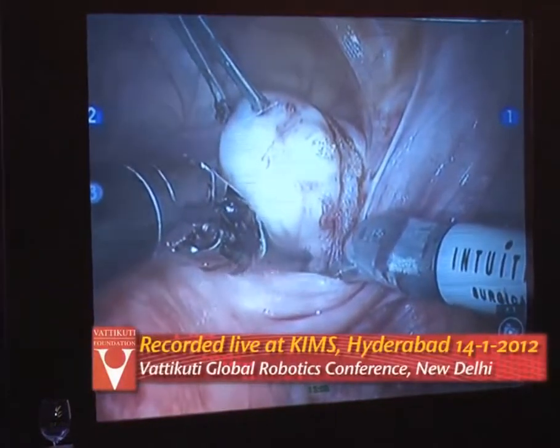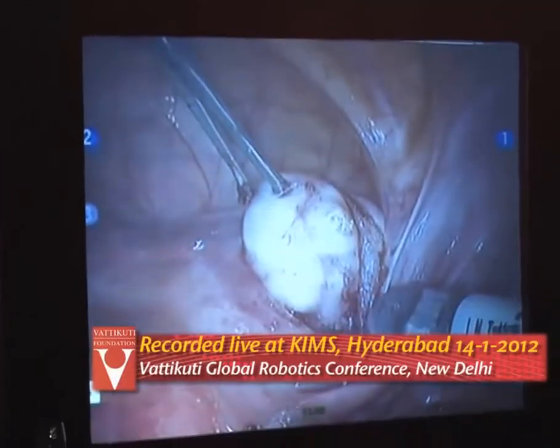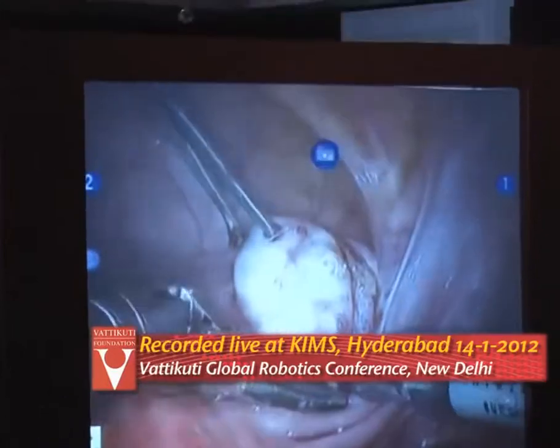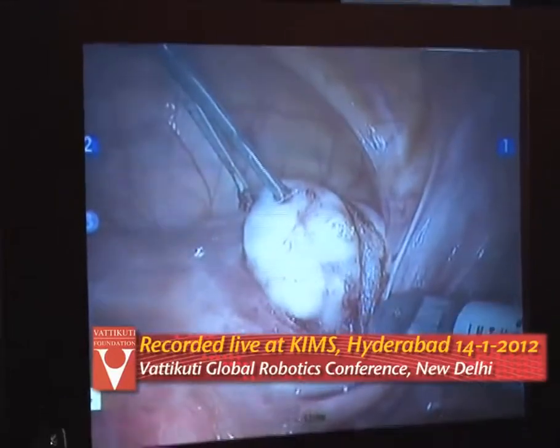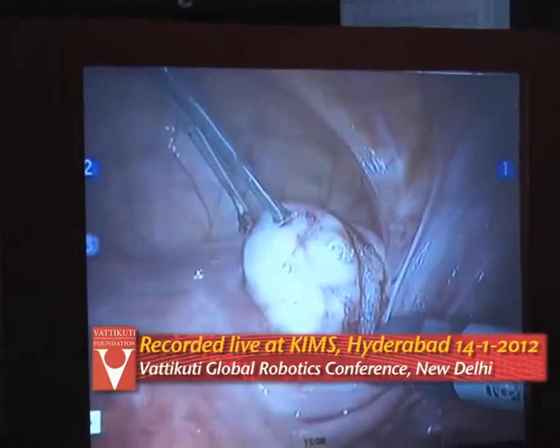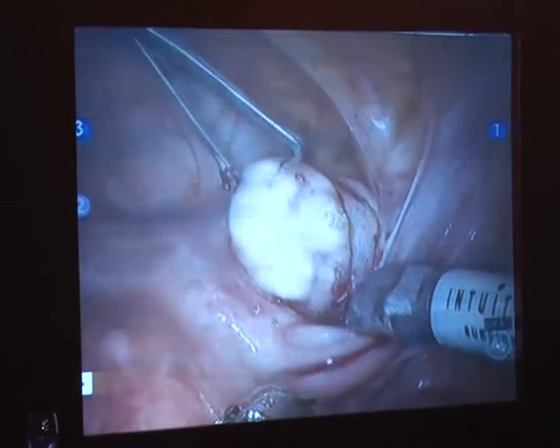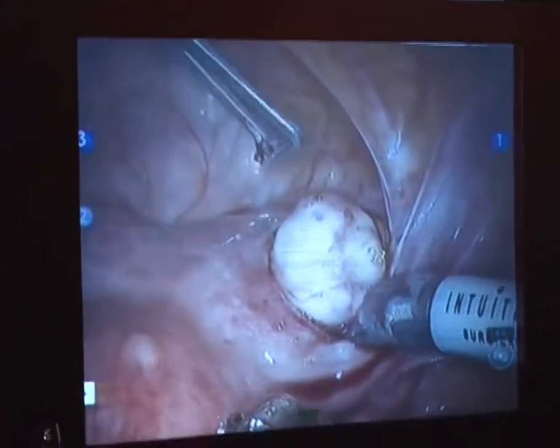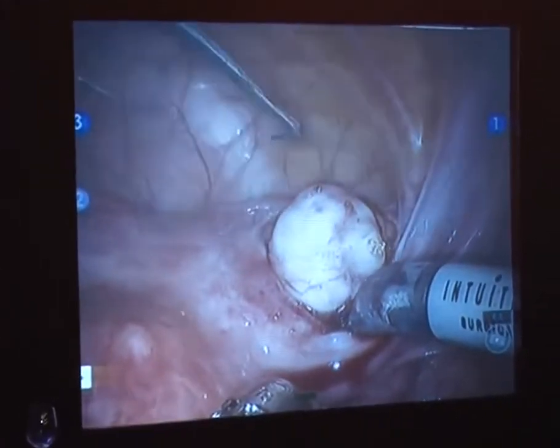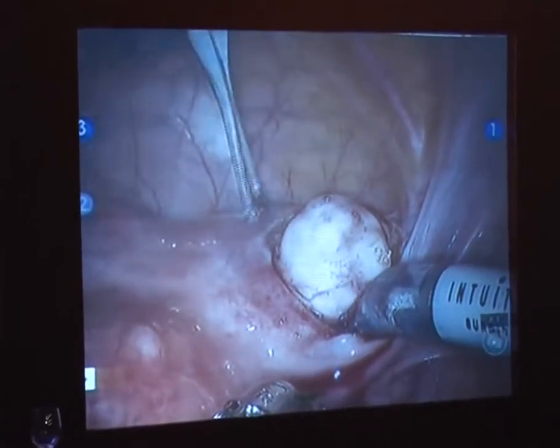It's amazing how these are always the tip of the iceberg as you get into them. Absolutely. See that? Bigger than what you would think. The thing that's interesting about broad-ligament myoma is often there's not a lot of defect to fix when you're done. The key is to figure out where it's specifically attached. That's really the main issue here. Just trying to understand where this guy is hooked up.